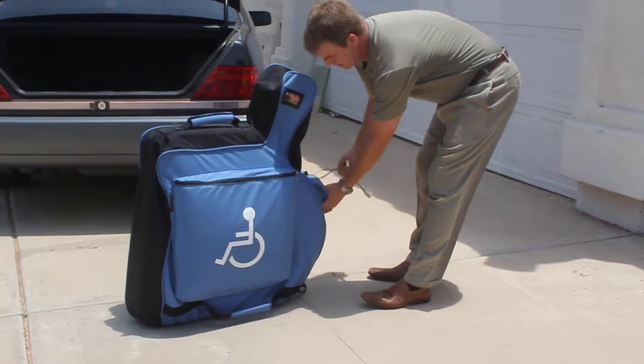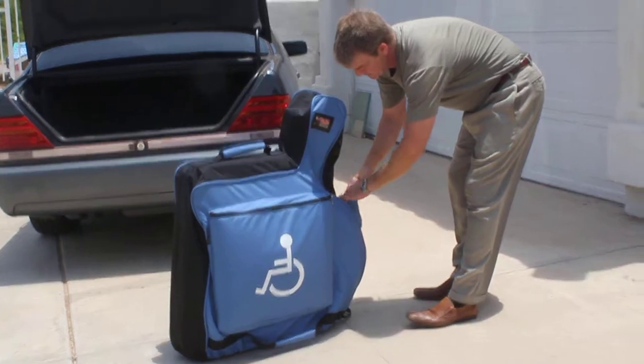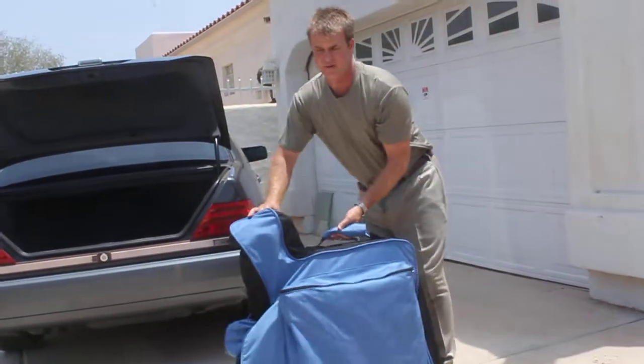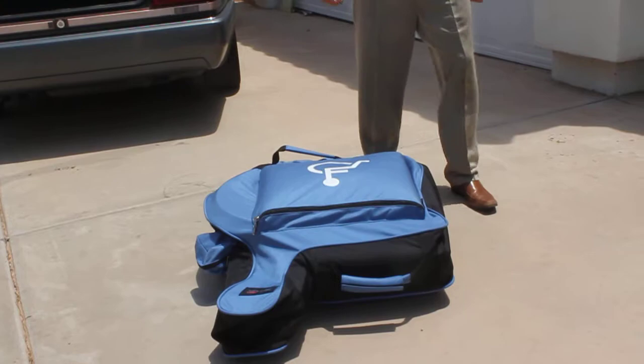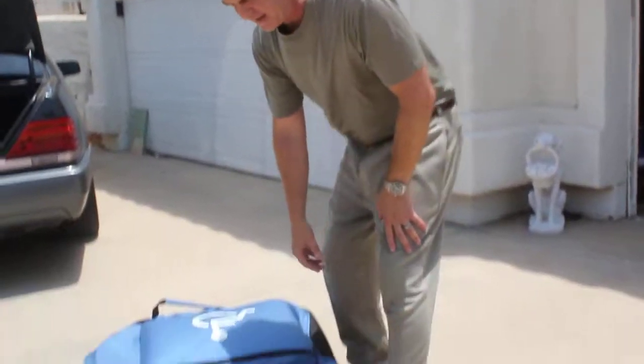You also have a zippered pocket for air when you're traveling on the airlines. How does it work? Beautiful. You're not going to hurt your wheelchair in any way, shape, or form. Even the monkeys in the airlines are not going to hurt the wheelchair inside when it's in our wheelchair carrying case.